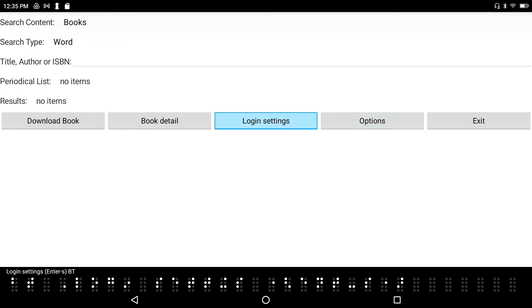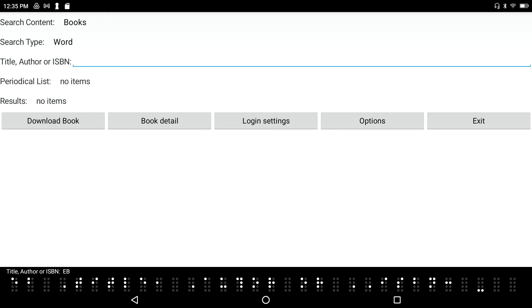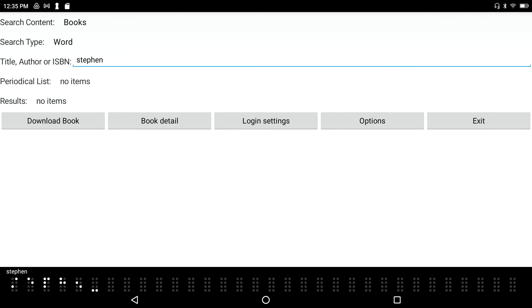I'm in contracted Braille so I'll press S-T-E-P-H-E-N Stephen, and K-I-N-G King. Press Enter.